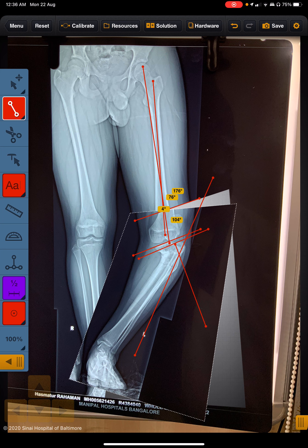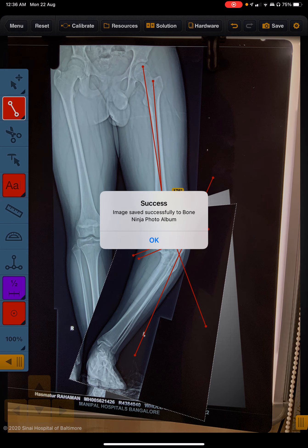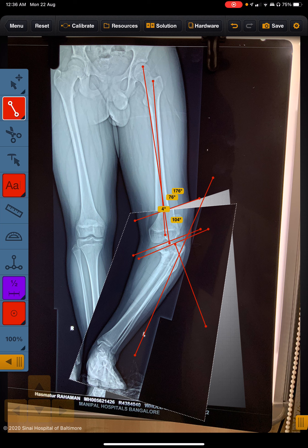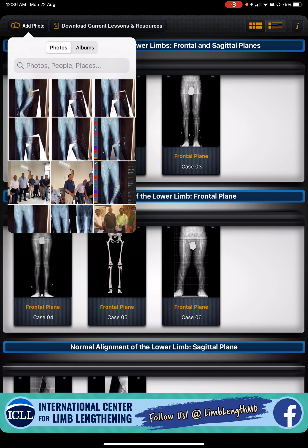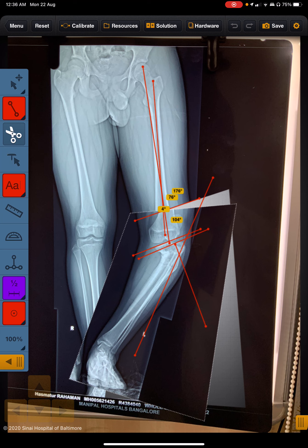Now we have corrected the femur. Now again we have to correct the tibia. Let's go back to the menu and select this photo again. Now we are going to do a different operation from here — opening wedge at this level. This is the photo.